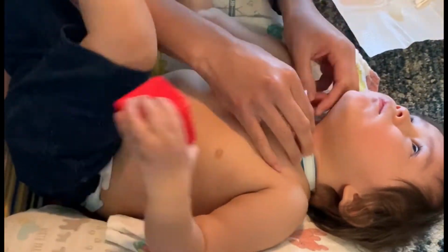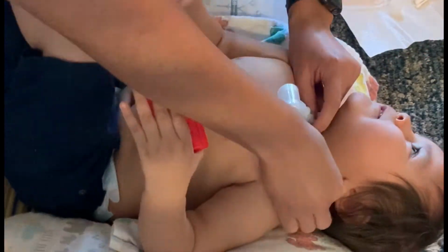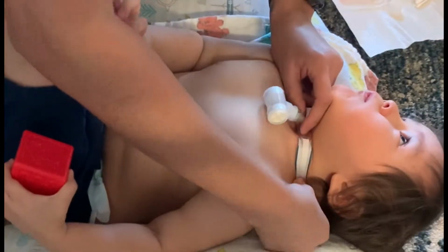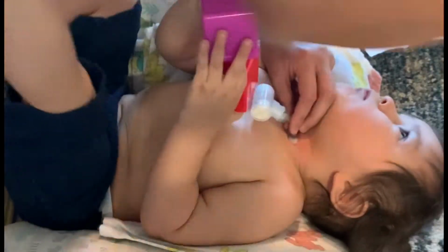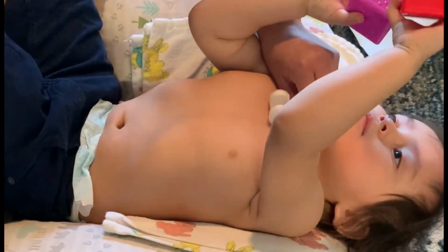And then for me personally, it's easier to take off the whole trach tie rather than just one side. So that's what I'm doing now. And then after I take this off, I'll wipe underneath the trach on both sides and then around his neck, then wiping the back of his neck as well.